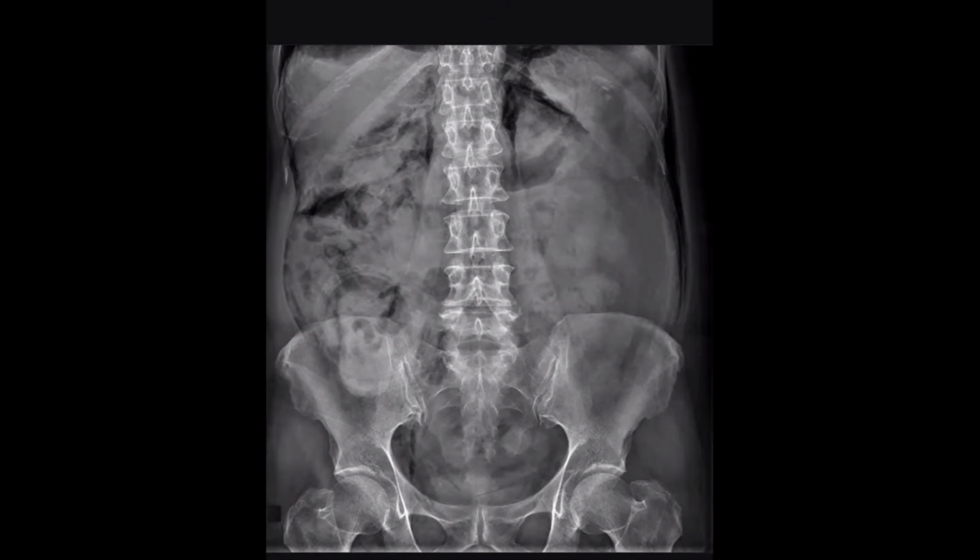Sir, we have an ileostomy bag. It can be due to any operation. Yes, maybe surgical. This case underwent right hemicolectomy with ileostomy bag. So this one is considered one of the causes, iatrogenic causes. What else?